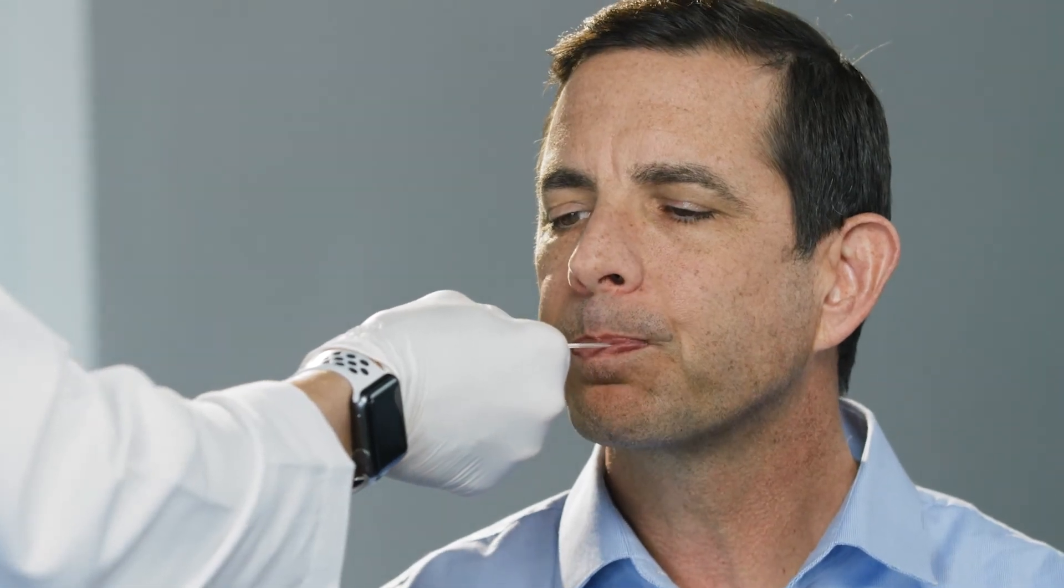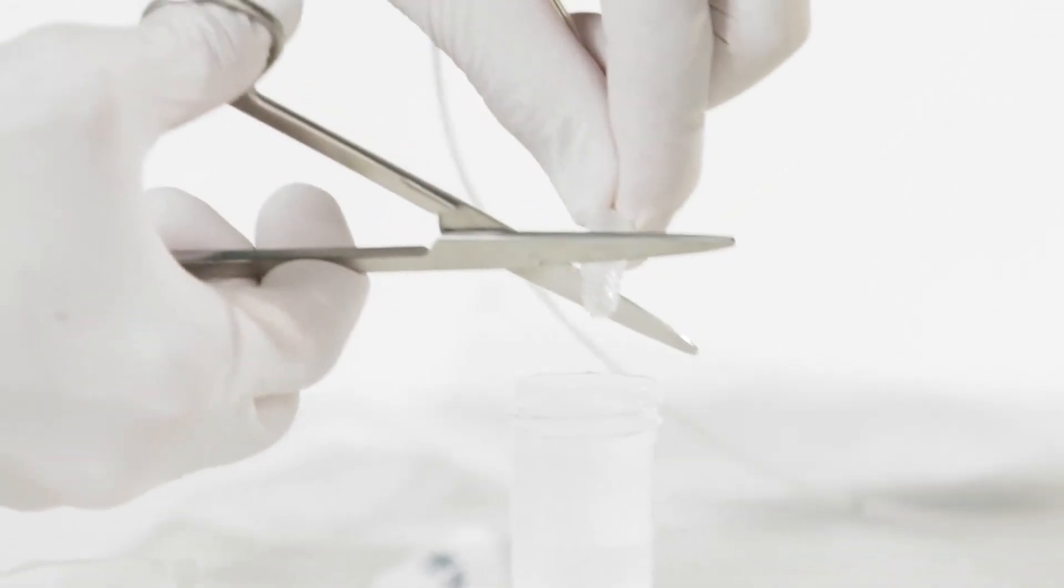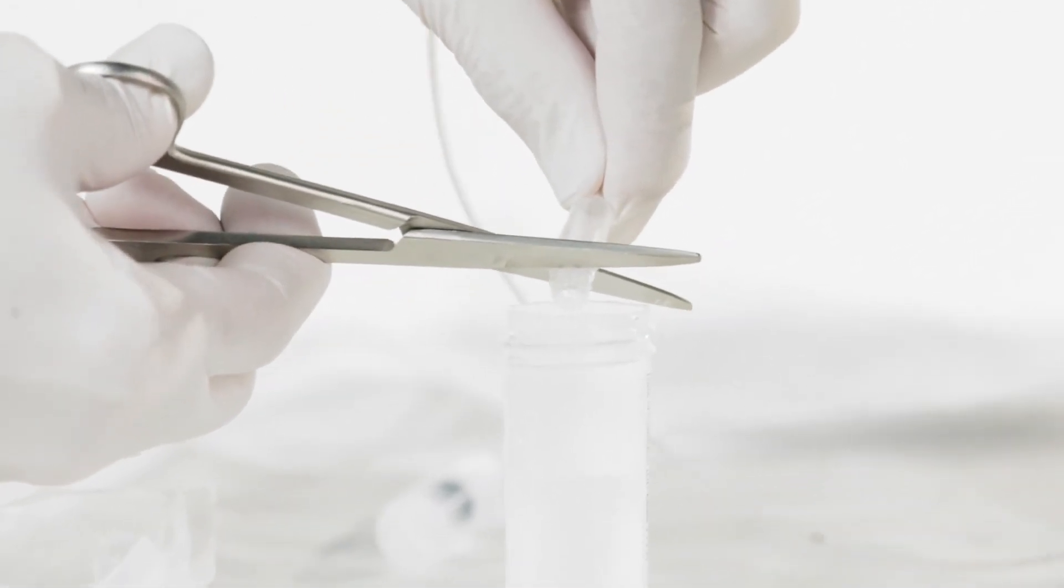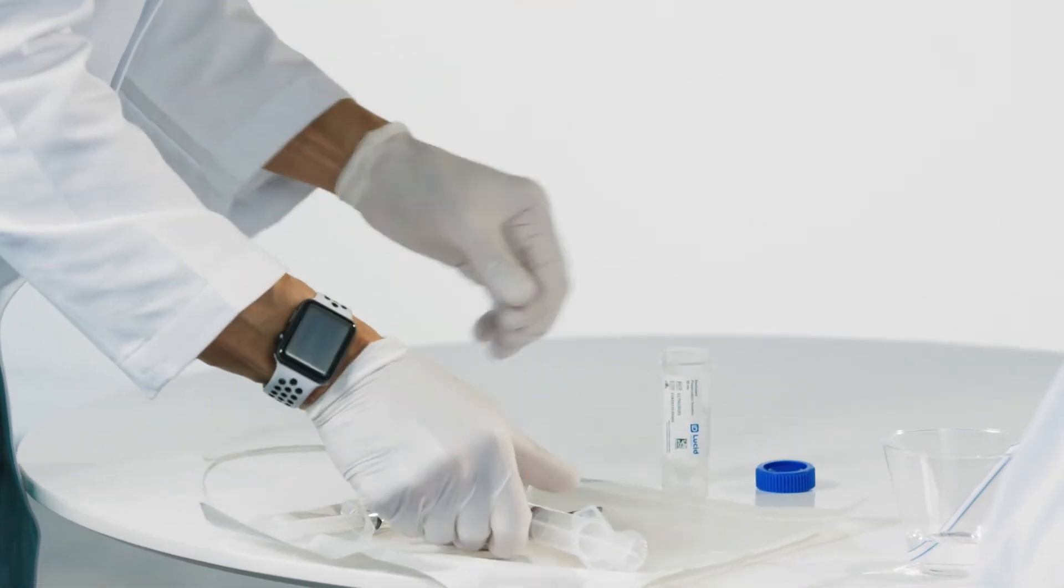To conclude the procedure, your doctor may ask you to swallow as the capsule reaches the back of your throat. They will remove the capsule from your mouth and the balloon portion of the capsule is removed from the catheter and placed in a preservative solution to be sent to the lab for analysis.